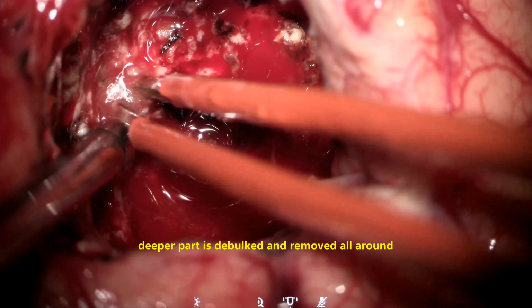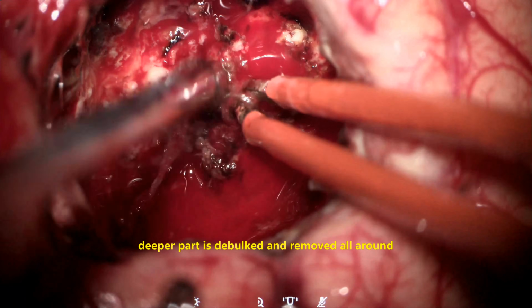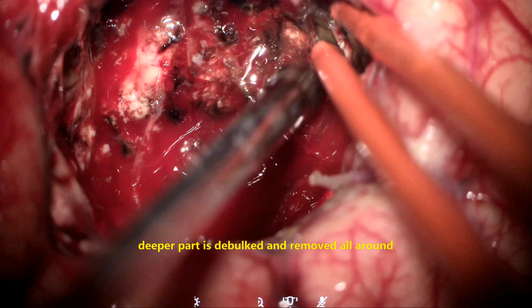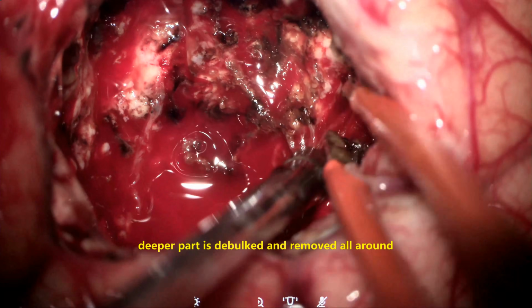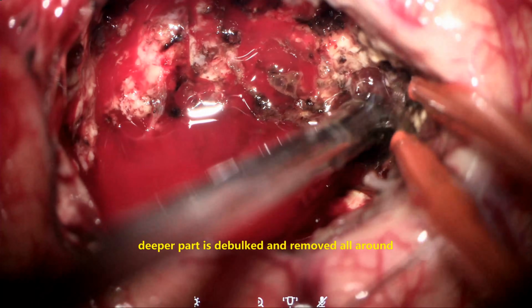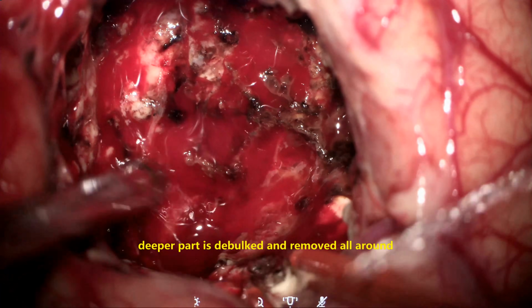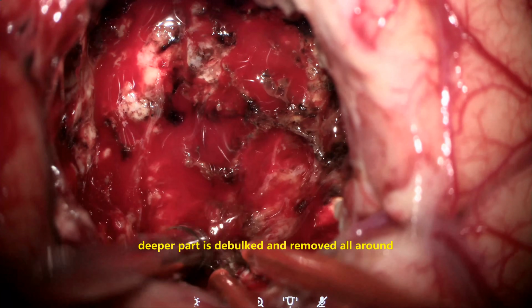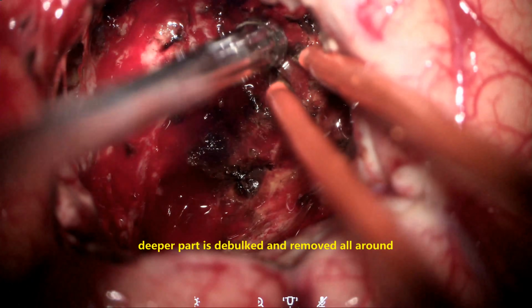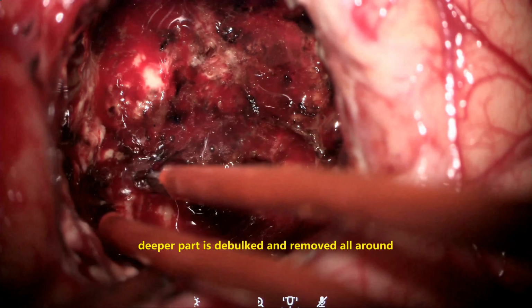Now, with high illumination and high magnification, as I mentioned earlier, keep achieving hemostasis at every stage and proceed. Now we have reached the deeper part of the tumor. You can see the hemostasis being achieved at every stage, and we proceed further. This is from all around. We have debulked the tumor and are achieving hemostasis. Then further you go down, once you achieve the hemostasis and debulk the tumor subsequently.